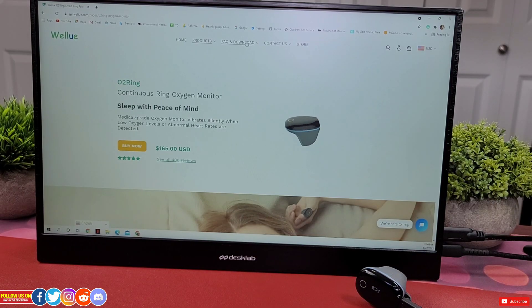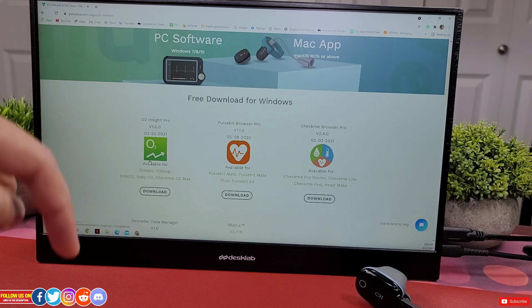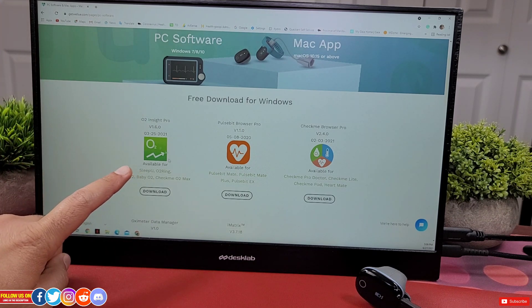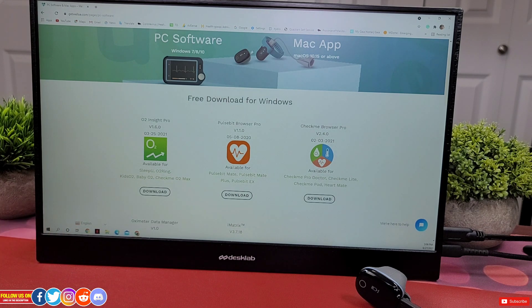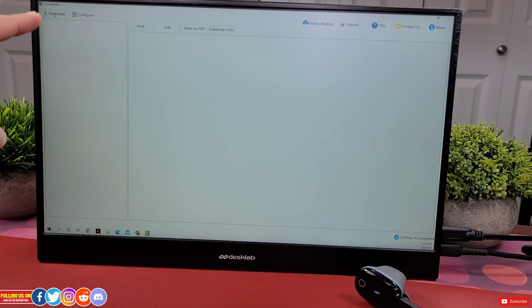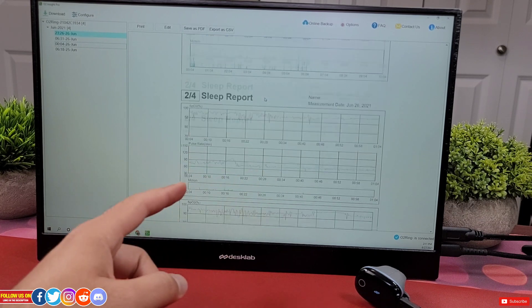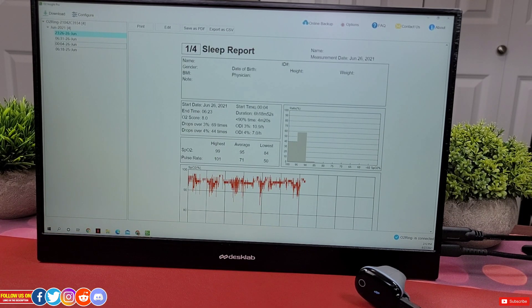You can also use a PC to transfer readings. Download the PC or Mac software for free from their website, linked in the video description. Make sure you download O2 Insight Pro as it is the correct software for the O2 ring. Once installed, open the app, plug in the cable, then click the download button on the top left and it will start downloading the stored readings. After that you can print, edit, save as a PDF, or export as CSV. I find the data from the PC is easier to read and navigate. If you want to fill in your details before exporting, click the option button to do so.